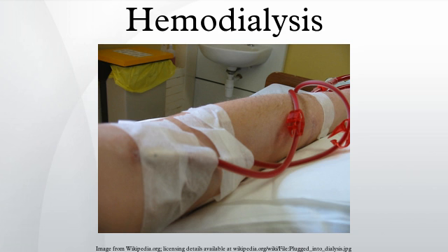The dialysis solution that is used may be a sterilized solution of mineral ions or comply with British pharmacopoeia. Urea and other waste products, potassium, and phosphate diffuse into the dialysis solution. However, concentrations of sodium and chloride are similar to those of normal plasma to prevent loss. Sodium bicarbonate is added in a higher concentration than plasma to correct blood acidity. A small amount of glucose is also commonly used. Note that this is a different process to the related technique of hemofiltration.